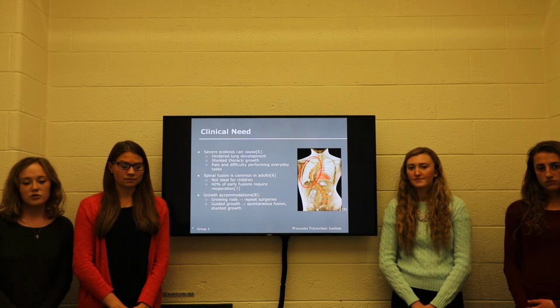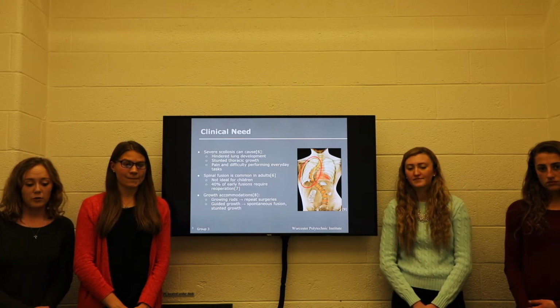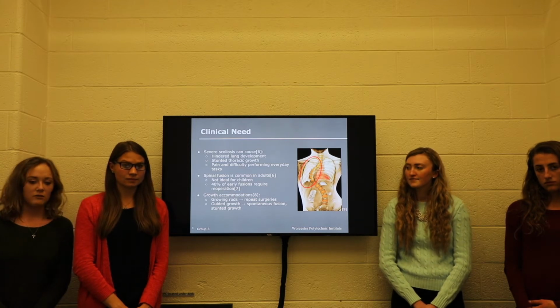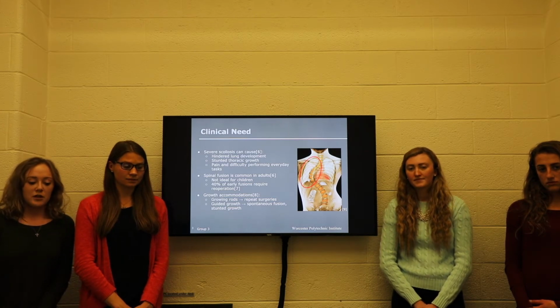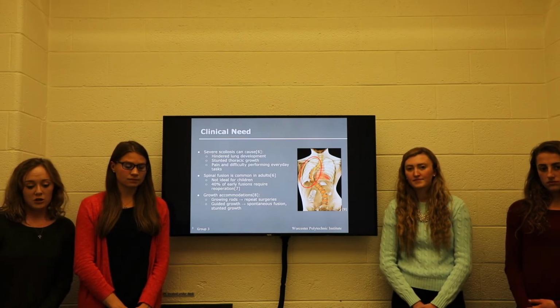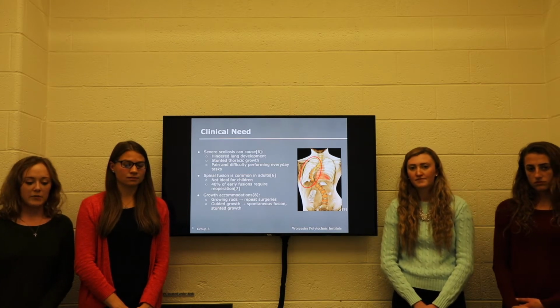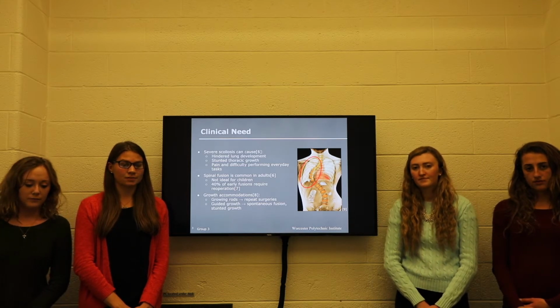Spinal fusion is a common treatment for adults, which involves surgically immobilizing the vertebrae with bone grafts. This is fine for adults as they're done growing, but isn't a really great treatment for children as they still have a lot of spinal growing to do. With this, approximately 40% of early fusions require reoperation, emphasizing that this procedure really should wait until the last time that it's needed. Therefore, there's more time to allow growth for the child.